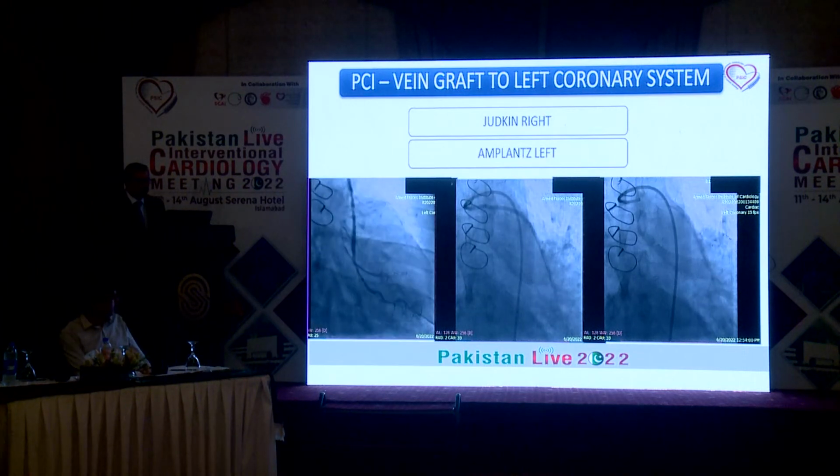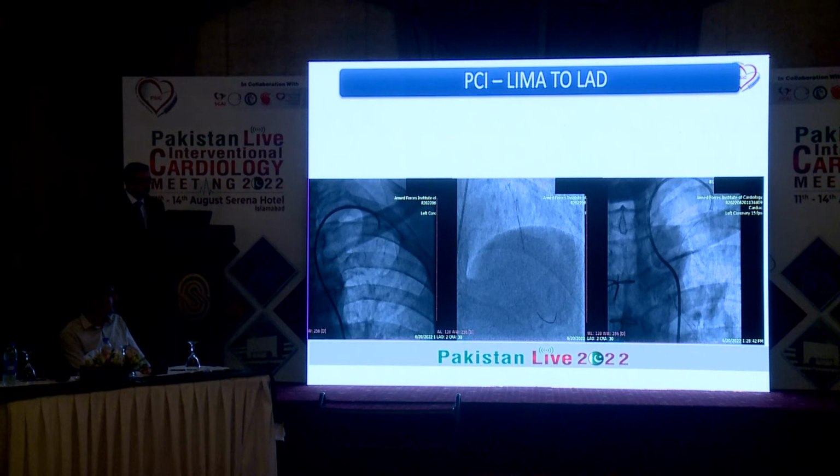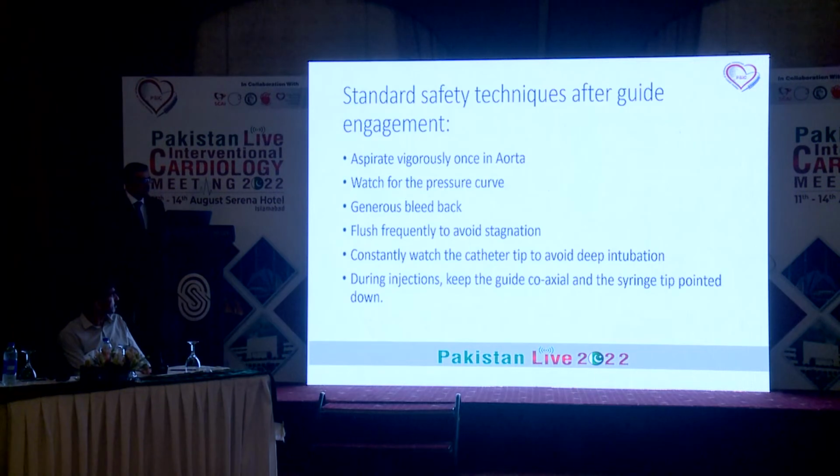Again, a graft PCI in which appropriate guide is taken and successful PCI is done. So these are some standard safety techniques which you should adopt when you are doing an angioplasty.